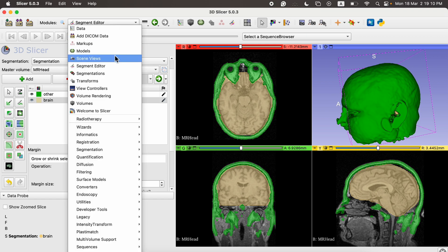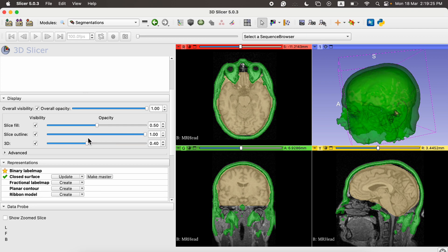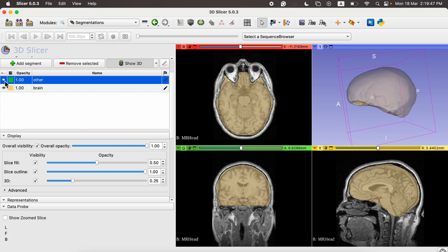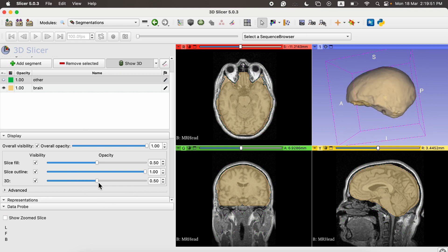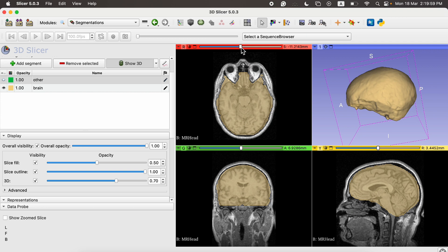To visualize the segmentation, go to the Segmentations button. Here we have different options — we can change the visualization, see the slice outline, and adjust visibility in 3D form. If we only want to visualize the brain we can click the eye button to hide the artifacts and we are left with only the brain region. These are all the slices generated using the semi-automatic method.